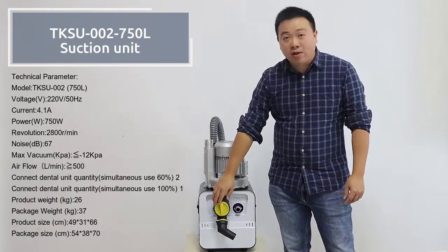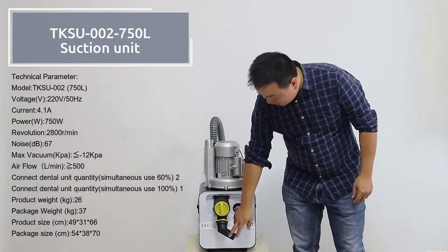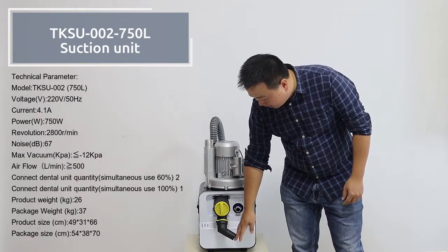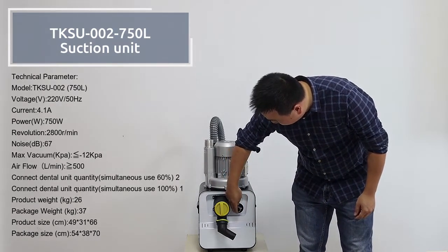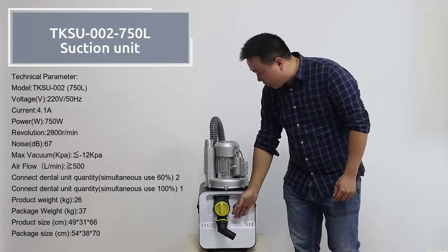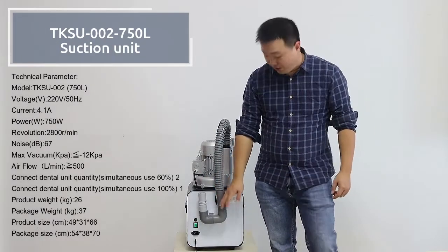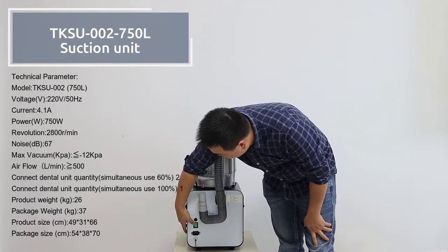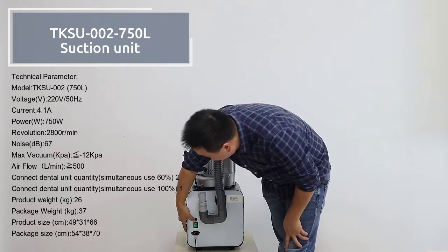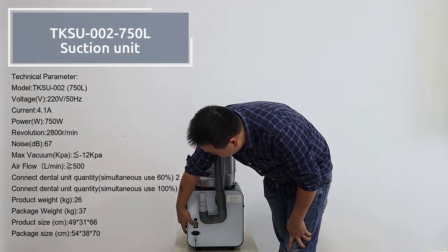In front of this machine you can see there is a filter here, and this side is for the suction connection. This one is for the drain interface — water drains out from here. On the back of the machine it also comes with different sides, and this switch is for the motors.